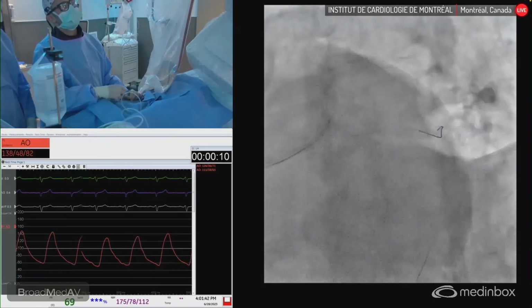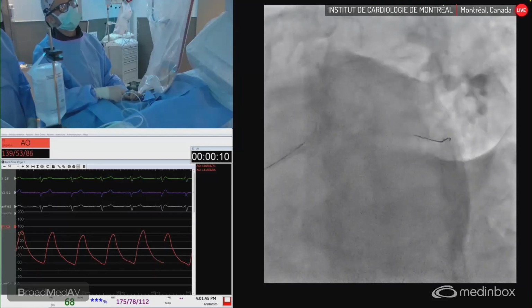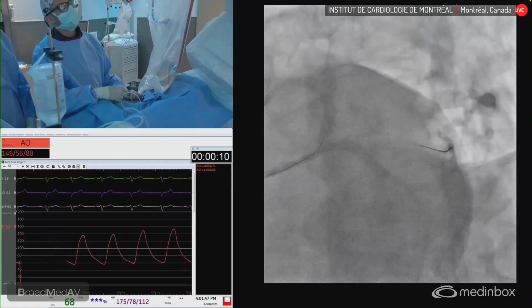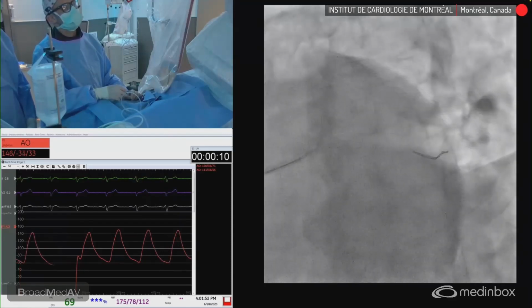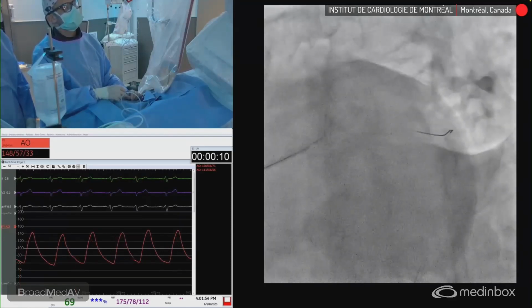That's great. I think you're almost there. I wonder if I'm behind a strut. Well, maybe. Be careful because you could be in the proximal part of the stent. Exactly. Try to go a bit more distal, and come back.